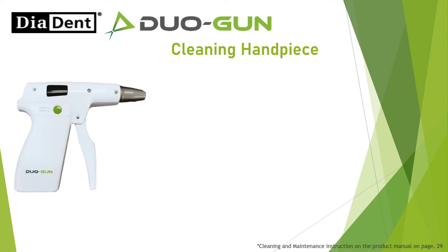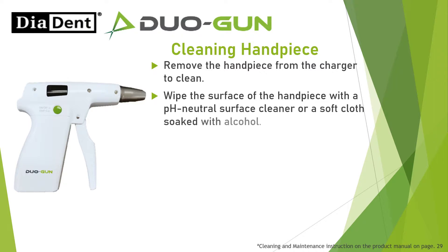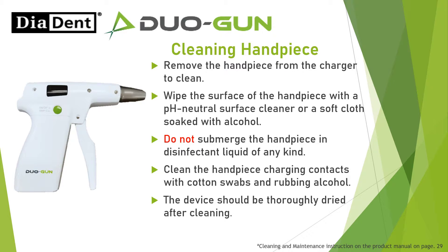Handpiece: Remove the handpiece from the charger to clean. Wipe the surface of the handpiece with a pH neutral surface cleaner or a soft cloth soaked with alcohol. Do not submerge the handpiece in disinfectant liquid of any kind. Clean the handpiece charging contacts with cotton swabs and rubbing alcohol. The device should be thoroughly dried after cleaning. Do not autoclave.